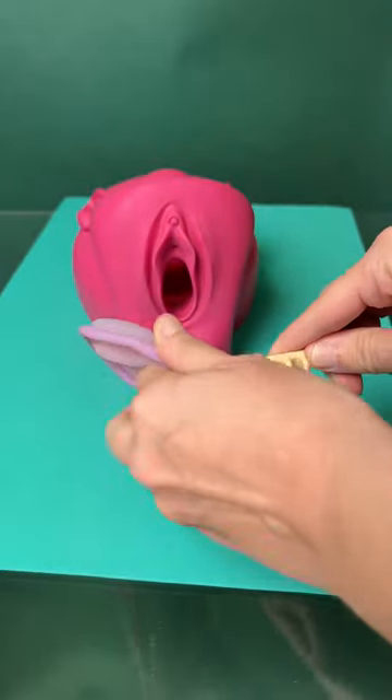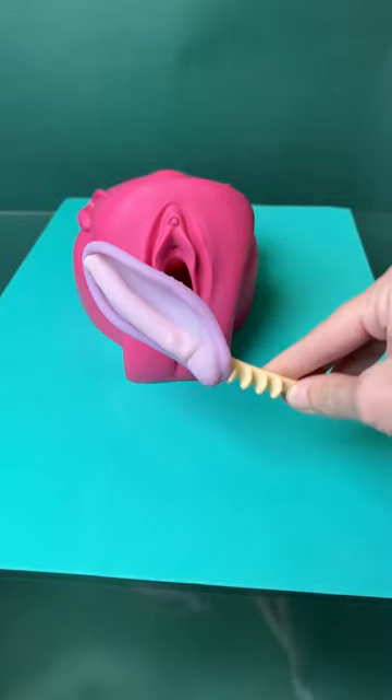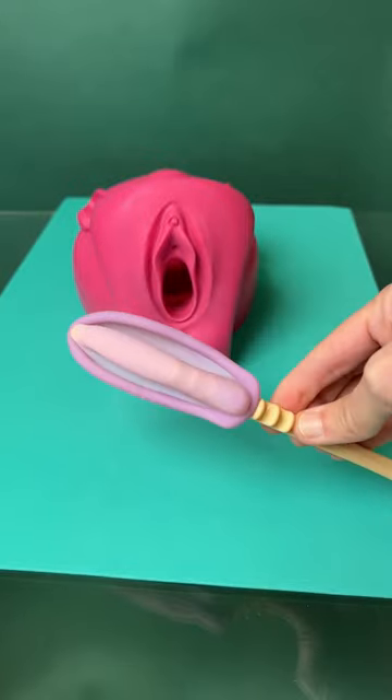Diaphragms are a lot like menstrual discs. To start, you want to take the top hook and find the rim, and then pull the bottom of the diaphragm onto the notch. You can pull it tight — and the tighter you can get it without it popping off, the skinnier and thinner it's going to be.